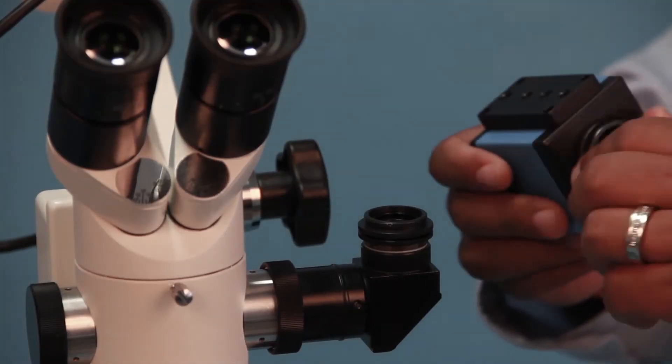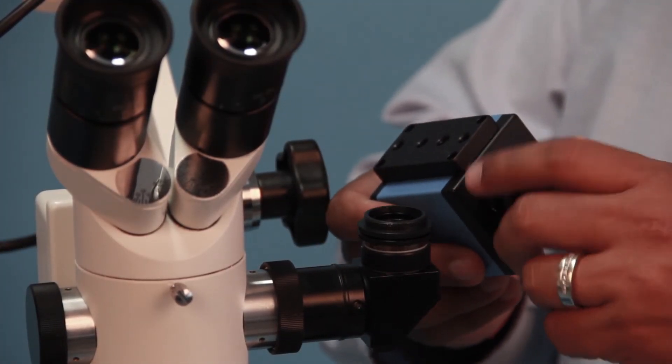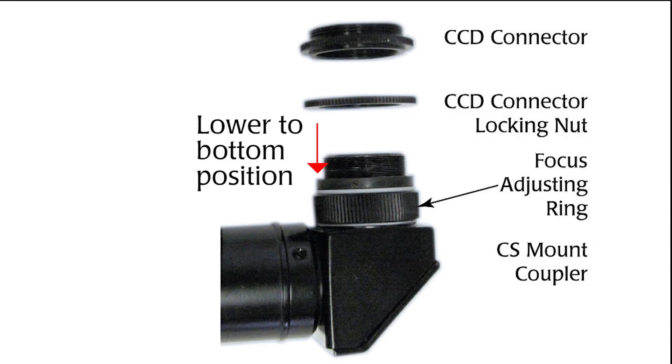Remove the camera lens cover and the 5mm extension ring from the camera. Lower the CCD connector locking nut into the lowest position on the CS mount.